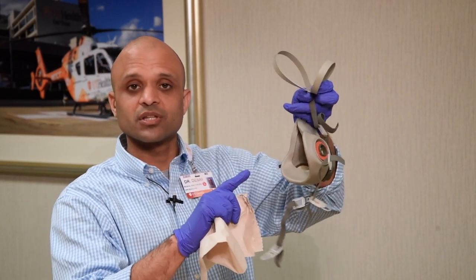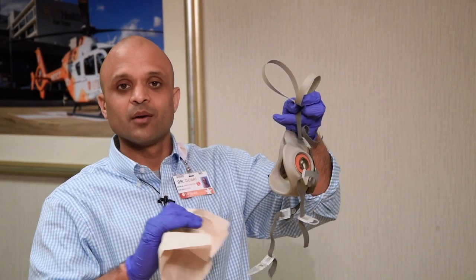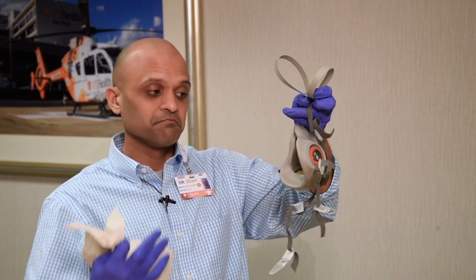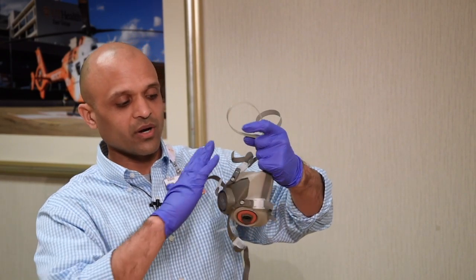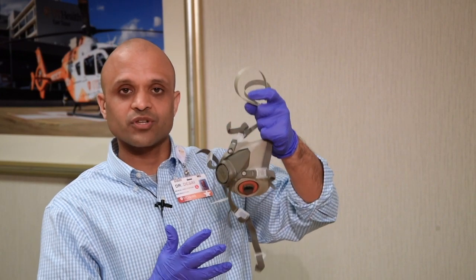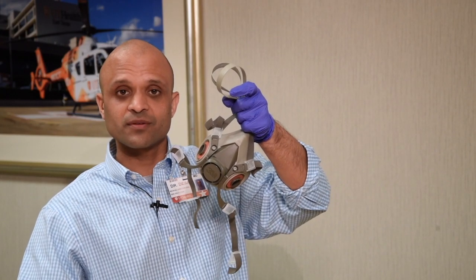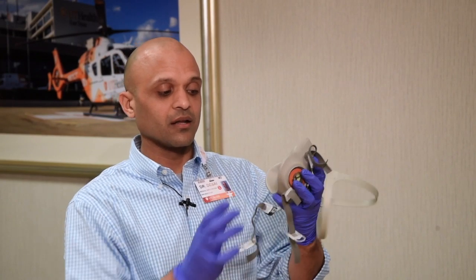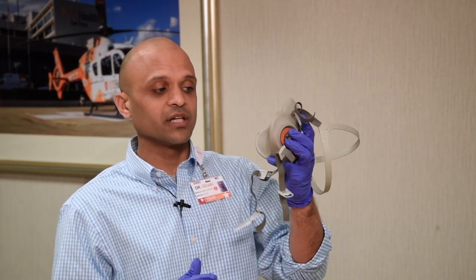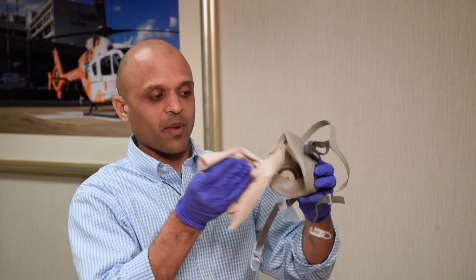Hopefully you didn't touch the inside of your mask — you never want to touch the inside — but I know sometimes it's difficult. So if you did actually touch the inside, what I recommend is you wipe the whole outside of your mask first, then place it on a disinfected clean surface, change your gloves, put on clean gloves, and hold the mask on the outside with your clean gloves. Now you can take a fresh disinfectant wipe — not the same one, get a second one — and wipe the inside of your mask.